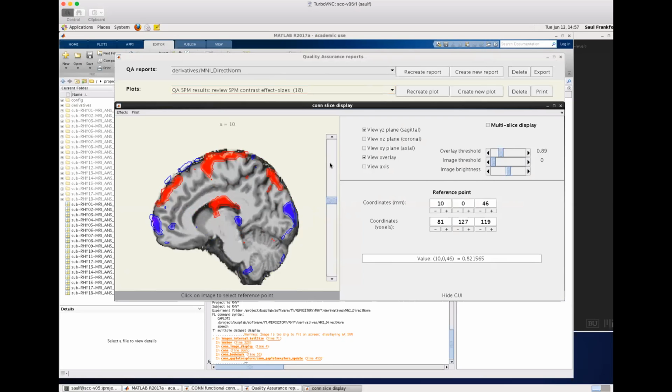If there is a lot of motion and you are averaging across all the time points, you typically get a much smoother looking functional image, and when you go to normalize that, perhaps the normalization doesn't work that well. But there are some things to try to correct to avoid that from happening, and one of the things that is trying to help you in that is the ART, which is creating this mean functional that is a little bit more robust. Instead of computing just the average activation across all the time points, it is computing the average activation limited only to the valid scans.